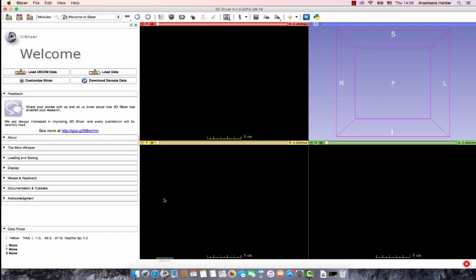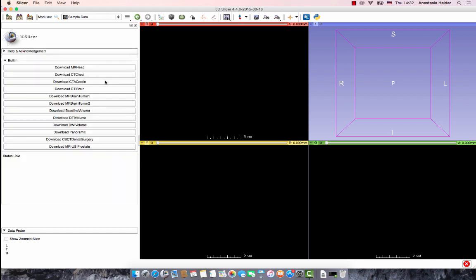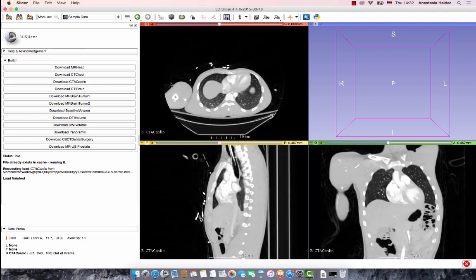After opening Slicer, go to download sample data, which is what I will be using. But you can also load your own DICOM data by clicking here. Next, go down to the CTA cardio scan to begin loading the dataset onto 3D Slicer.